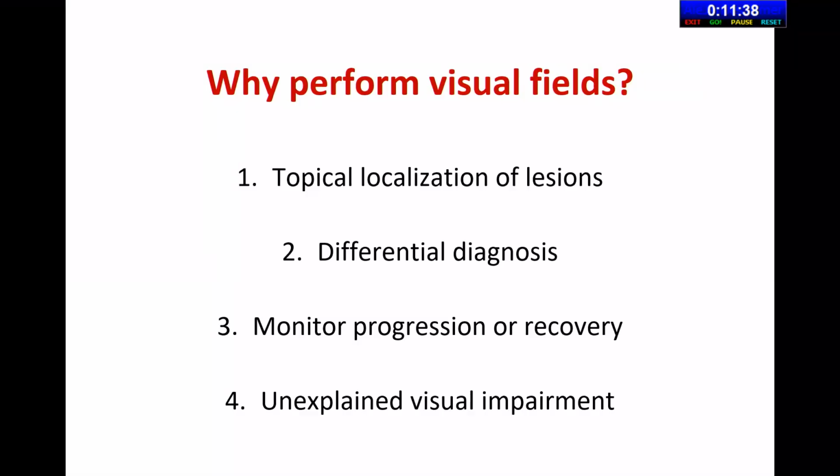I'm not just going to enumerate a list of visual fields from beginning to the end, but I'm going to show you a couple of illustrated lessons with this, and we'll end up with a plan on how to interpret fields at the end.